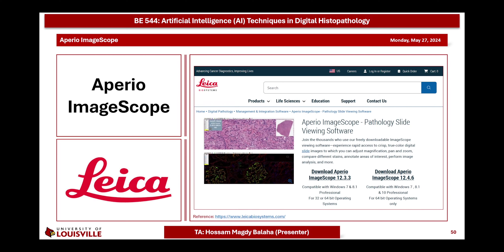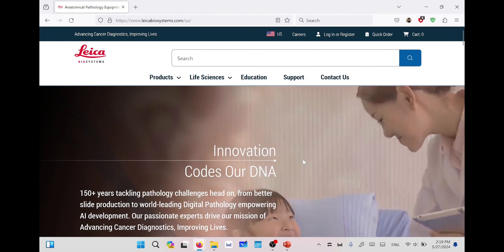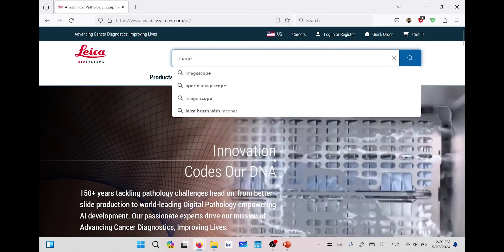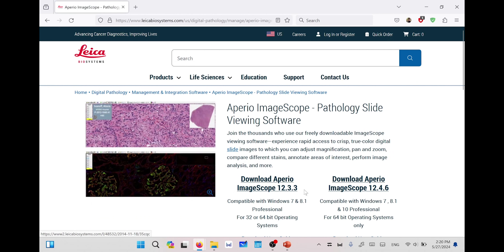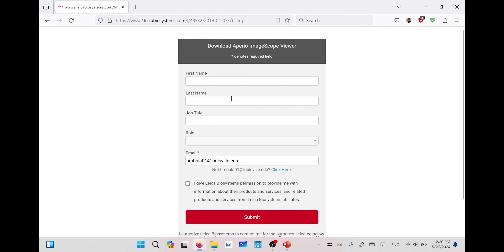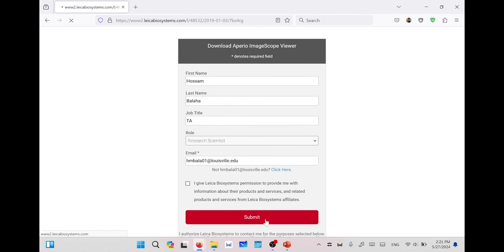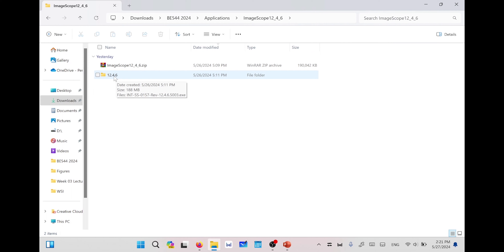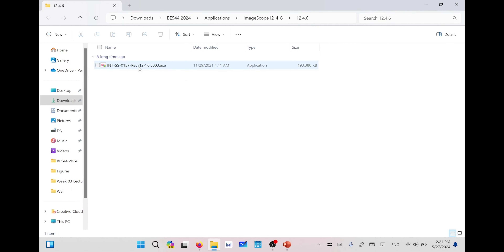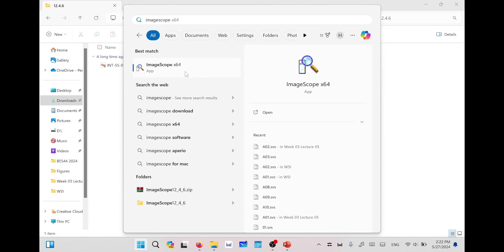You can download the software from the website. By navigating to that site you will find the interface of the website. You can search for ImageScope and then go to Aperio ImageScope and download either of the two available versions. If you download the latest one, you will need to fill in your first name, last name, job title, role, and email, then submit. You will find the download link, and after downloading you need to extract it and find the folder with the same version name, containing the software with an .exe extension to install on your computer.